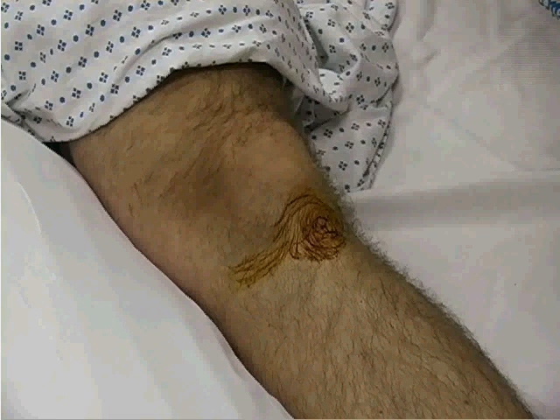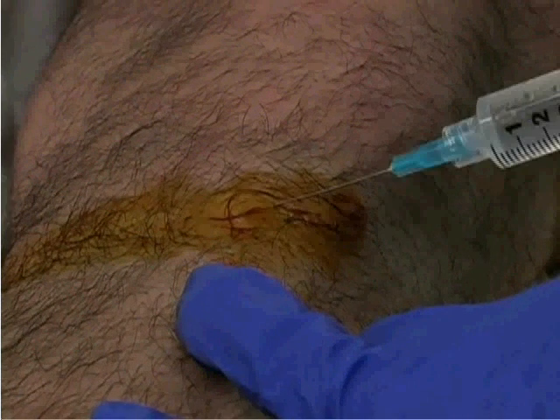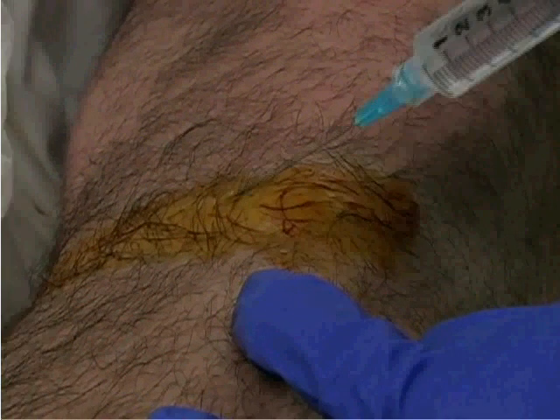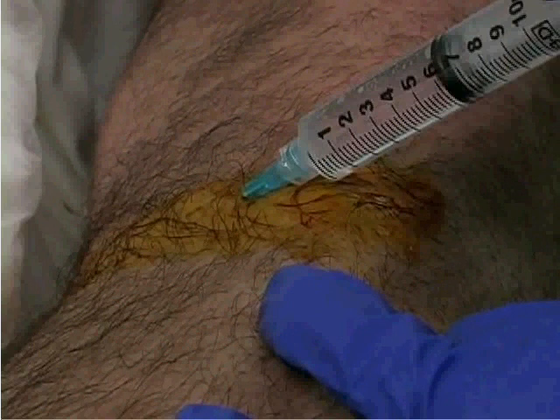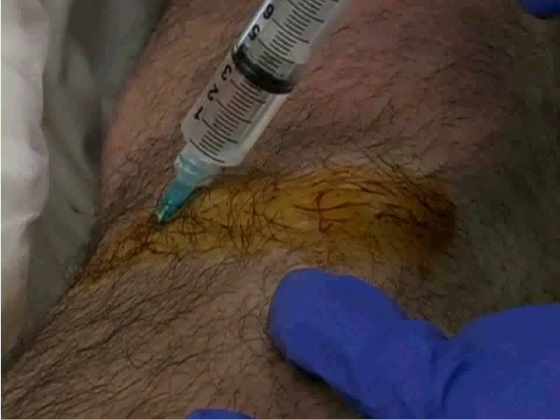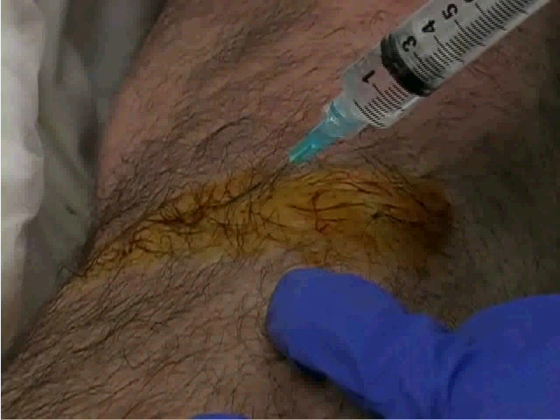Insert the 22-gauge needle into the cutaneous skin wheal at the tibial tuberosity. Direct the tip of the needle medially toward the tibial condyle, injecting anesthetic during insertion. Reinsert the needle into the cutaneous wheal 2 centimeters from the tibial tuberosity and again direct the needle medially. Inject the local anesthetic in a ring technique, infiltrating linearly to the dorsomedial aspect of the tibial condyle. Inject approximately 10 milliliters, causing the subcutaneous tissue to visually rise.